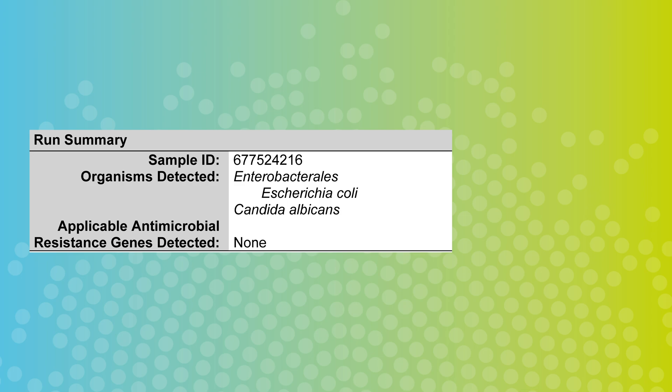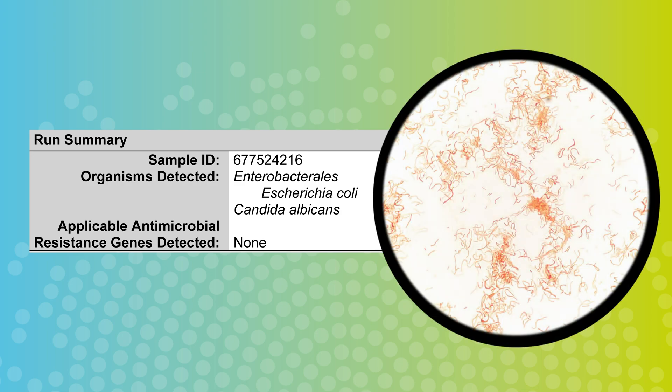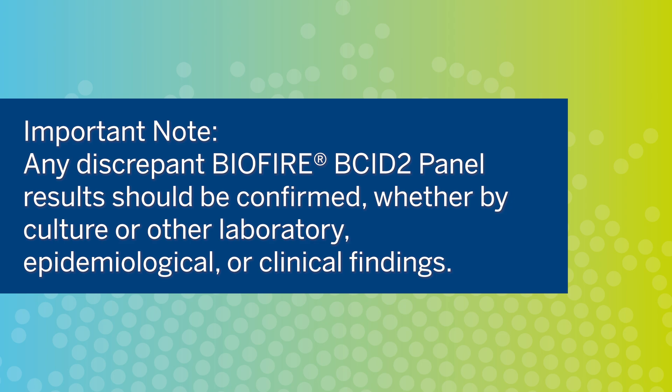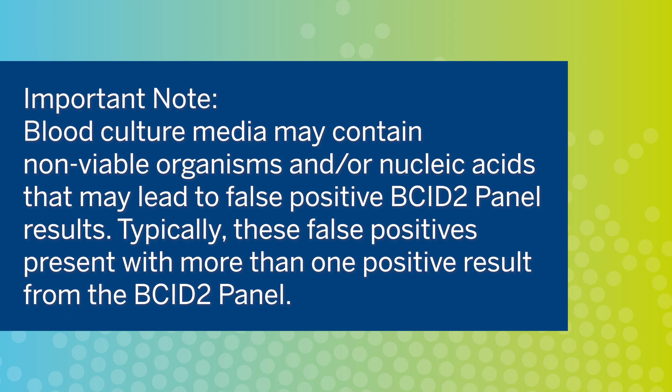What if there is a discrepant result? In this example, the BCID-2 panel showed E. coli and Candida albicans as detected, but the gram stain only showed gram-negative rods — this is considered a discrepant result. All BioFire BCID-2 panel results are intended to be interpreted in conjunction with gram stain results. In cases where the gram stain and BCID-2 panel results are discrepant, the BCID-2 panel results should be confirmed, whether by culture or other laboratory, epidemiological, or clinical findings. Blood culture media may contain non-viable organisms and/or nucleic acids that may lead to false positive BCID-2 panel results. Typically, these false positives present with more than one positive result from the BCID-2 panel.